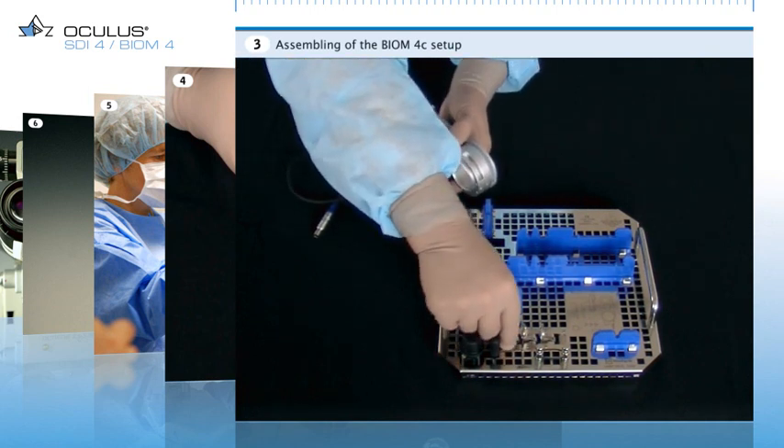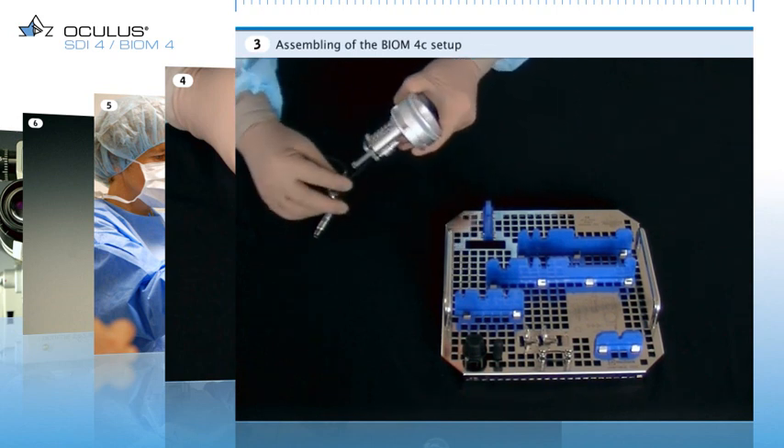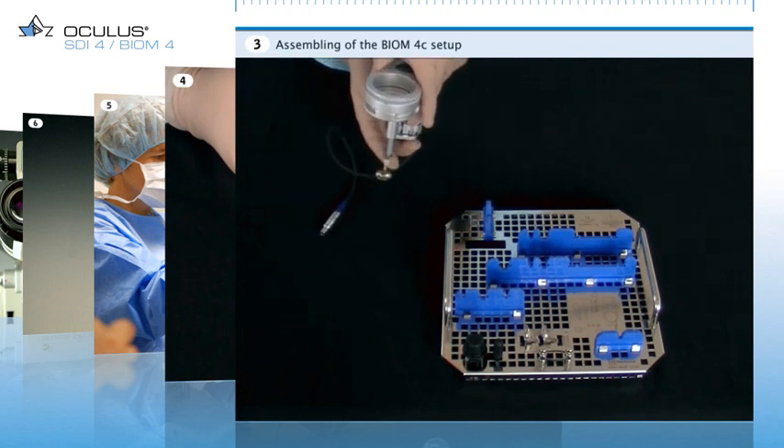Take an appropriate front lens and insert it into the lens holder at the bottom end of the Biome. Now the Biome is fully assembled and ready for use.